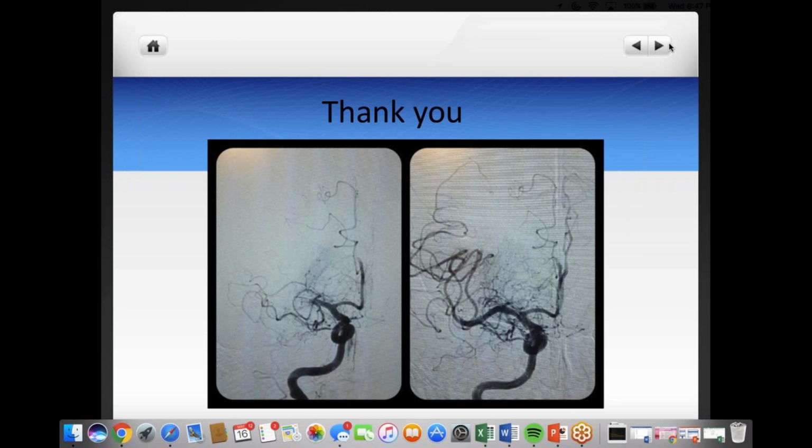Thank you, Dr. Serulle, for that excellent presentation. Looks like we do have one question right here off the bat. Question is, how does the contrast staining look like on an SWI imaging?